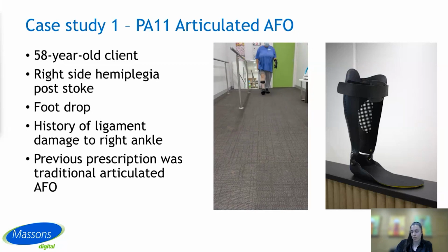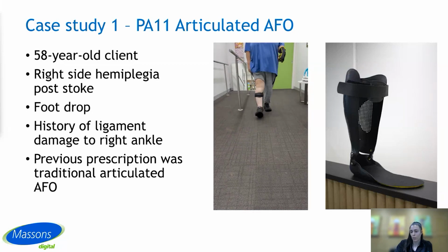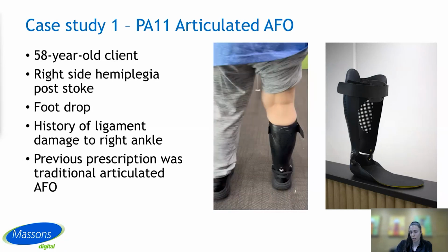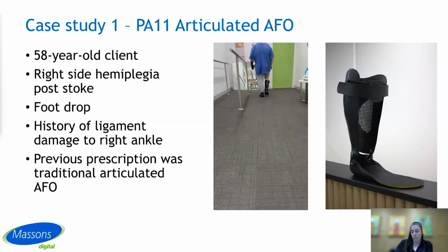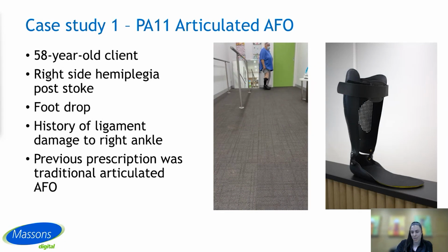Previously, she had worn a traditional articulated AFO with tamarack joints and a plantar flexion stop. But with this device, her biggest concern was that she found the device really heavy, bulky, and she struggled with heat during the summer.